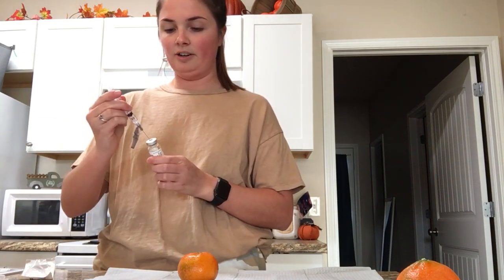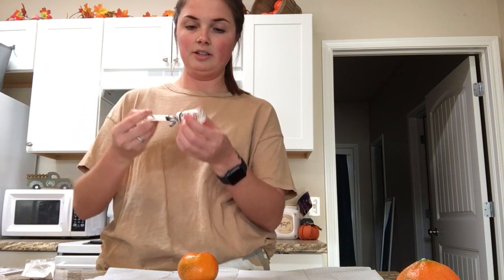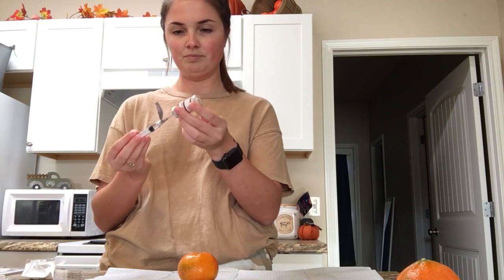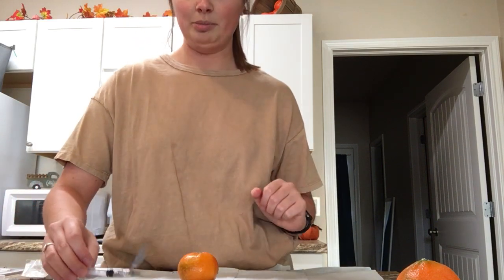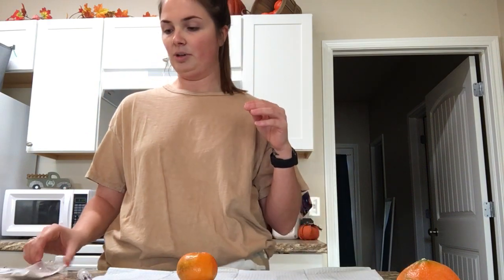stick it into the vial, blow out that 1 milliliter of air, tip the vial upside down, and again draw 1 milliliter of Zyprexa. So I'm going to pretend I put this on the clean area. So we're going to put the cap back on here just while we're getting everything ready.